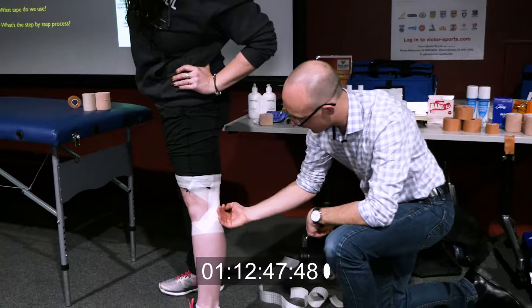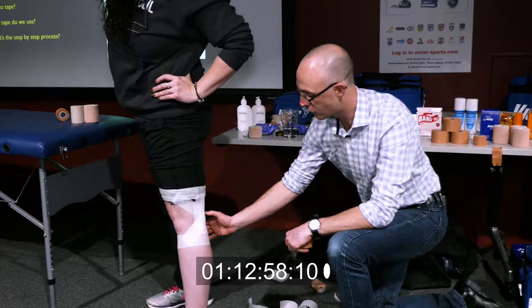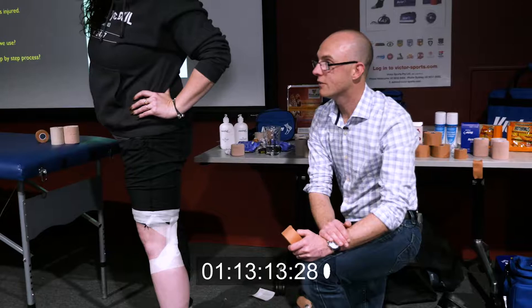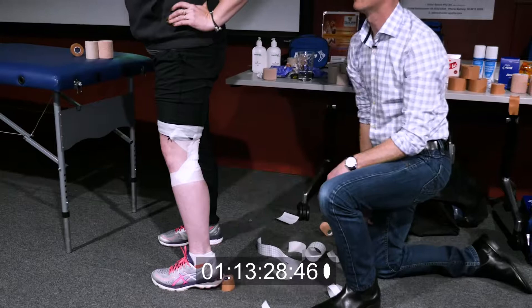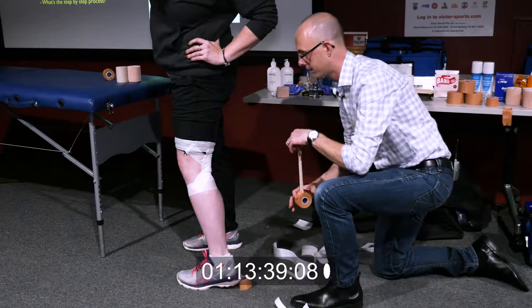If we're thinking about stopping hyperextension, her knee at the moment looks like it's in pretty much full extension. We don't want her to get to that point. In a sporting sense, we still need her to be functional. Can you just bend your knee a little? Just a slight bend — that's about all you need. A tip for keeping the knee in that slightly bent position: use one of those little plastic door wedges underneath the heel, which tilts the foot up and puts the knee in that position. Or when all else fails, just set the heel up on a roll of tape.